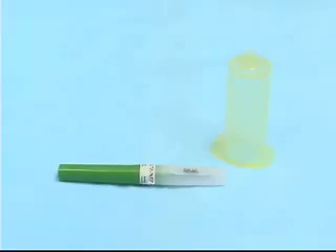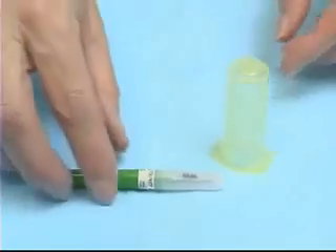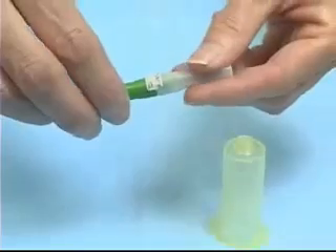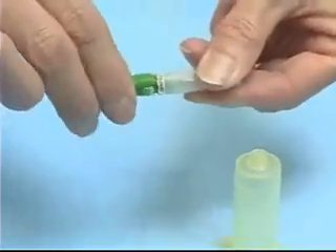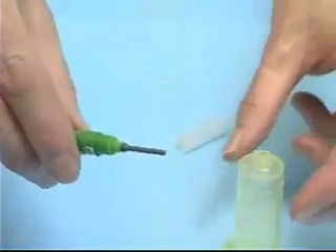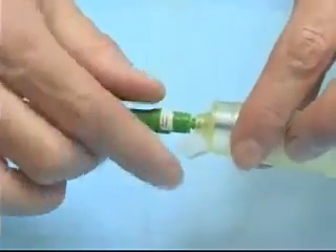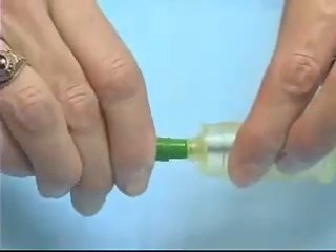In order to use the vacutainer, we need to put the vacutainer needle inside the vacutainer holder. I'm going to remove the clear end from the vacutainer needle and insert it into the vacutainer holder, and it screws tightly into place.